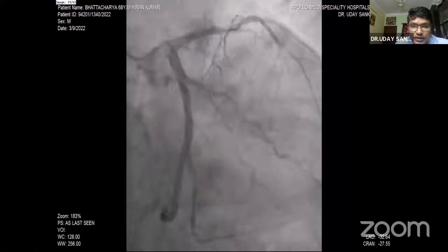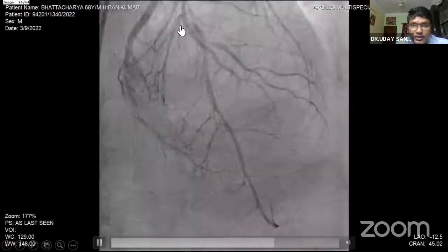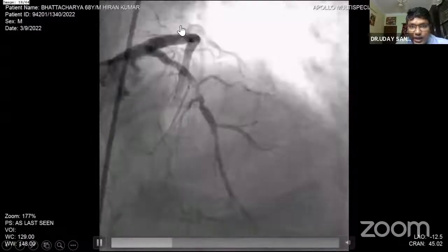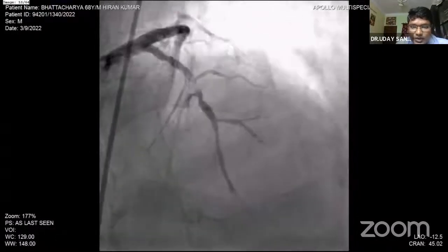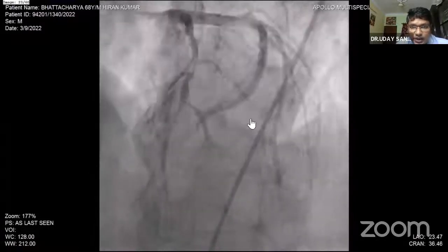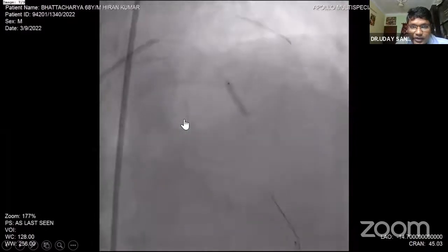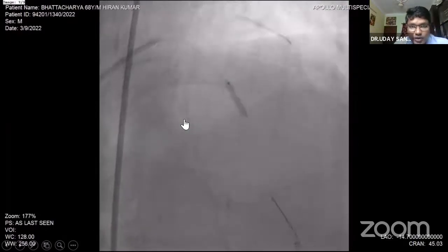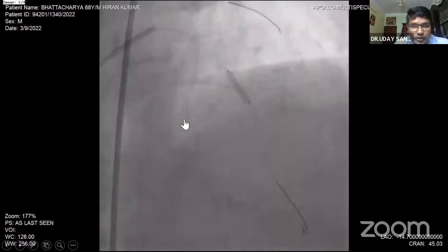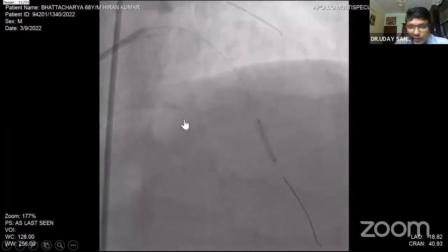The left shoot was taken. There's a critical thrombotic lesion just after the proximal part, just after the diagonal, and another lesion in the mid and distal LAD. This was a dominant left system and a critical lesion in the LPDA. Initially he was loaded with antiplatelet, ticagrelor. He had ongoing chest pain, so I redilated with a compliant balloon, 2.5 by 12.